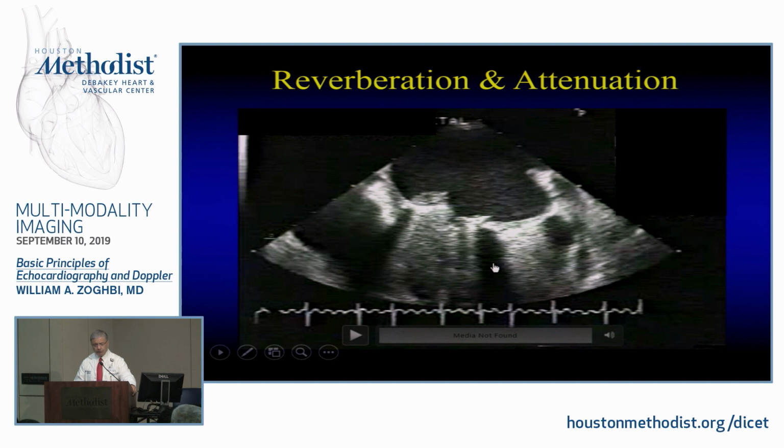If I don't penetrate and refract more going down, I'm not going to be able to interrogate that, so I'm not going to be able to see it. The same thing is going to happen with Doppler, because Doppler is addressing the equation of what you send out. So if all of it is reflected back, you're not going to see anything here. It'll be black. The same thing, it will be shadowing for Doppler, color Doppler, anything.